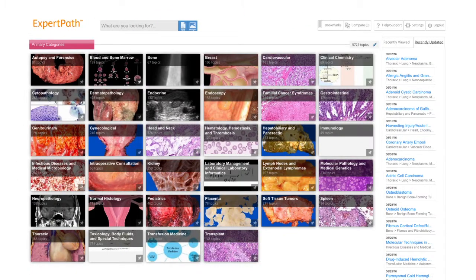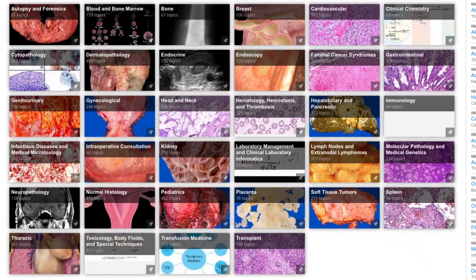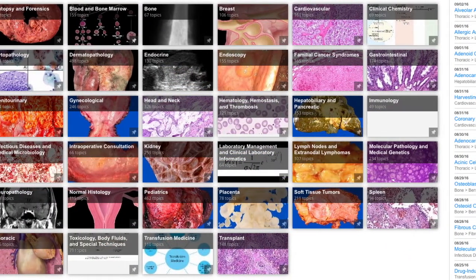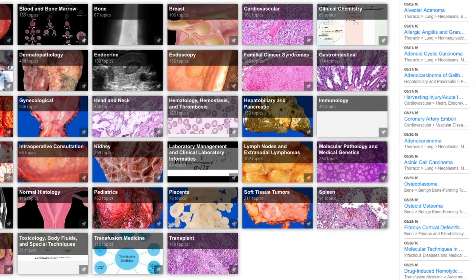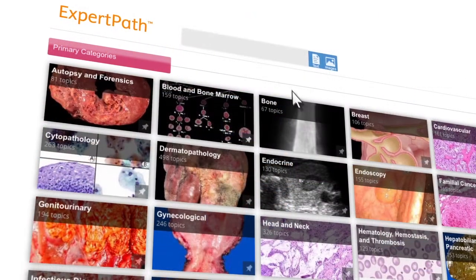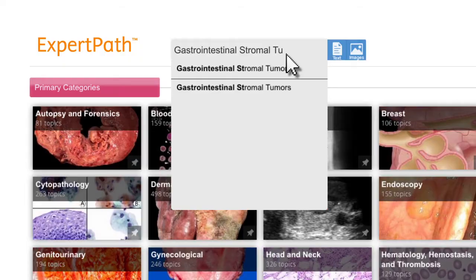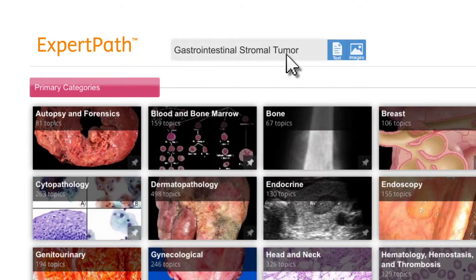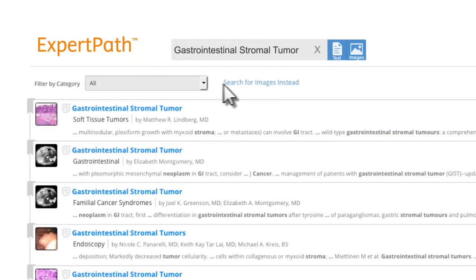Expert Path provides decision support guidance for both anatomic and clinical pathology. Waste no time by jumping directly into a category or by searching specific keywords. Furthermore, searches can be limited by category or by images.